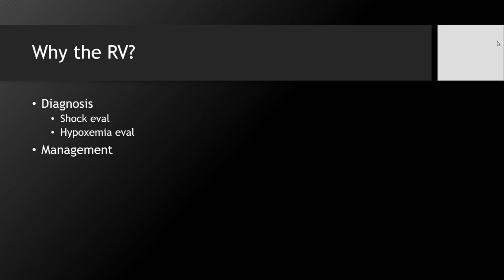Additionally, and this is something that I mention to our fellows when we talk about shock, sometimes POCUS is not necessarily needed to give you the specific diagnosis or the specific answer. Very often, especially in the complex patients that we have in our units, patients have multifactorial complex diseases that are contributing to a complex hemodynamic state. And so the purpose of POCUS isn't to say, oh, this is a PE, oh, this is tamponade.